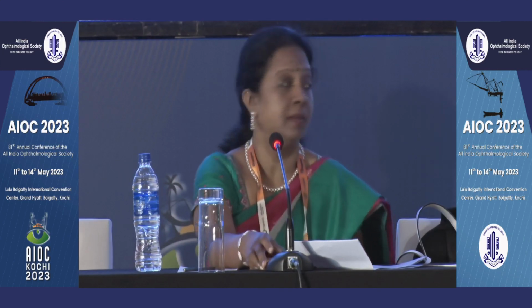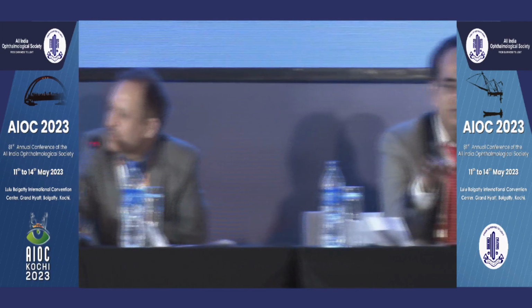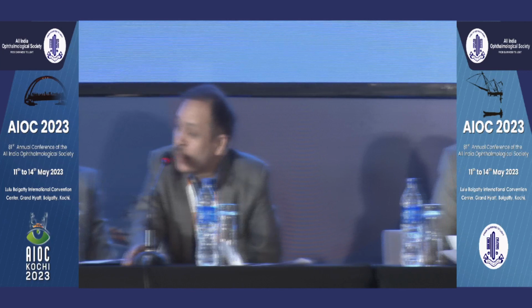If the first fields were unreliable, when did you repeat it for reliability? After how much time? Sir, let's move forward. The question is not for the audience. The question is for the presenter. If the first fields were not reliable, after how much time did you repeat it? We have to get a minimum of 3 fields. What was the time interval between them? Minimum 1 month, and then again 3 months we can do.